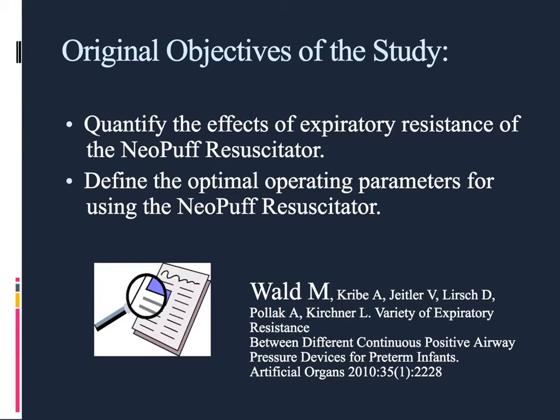Originally, the purpose of the study that we undertook was from some work that Wald and some others did when they were looking at different devices, and particularly the expiratory resistance of the NeoPuff resuscitator. So they were quantifying and examining the expiratory resistance of the NeoPuff resuscitator and some other ventilators, and that's what got us interested in this work. And our objective in thinking about this was to define the optimal operational parameters of the NeoPuff resuscitator to use in our neonatal intensive care units and at the delivery rooms.